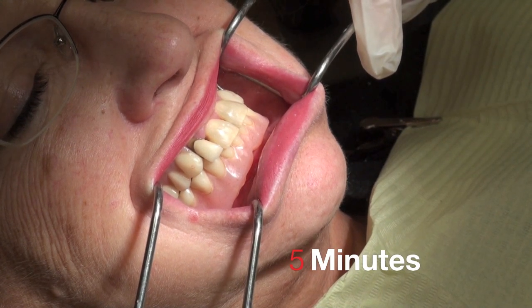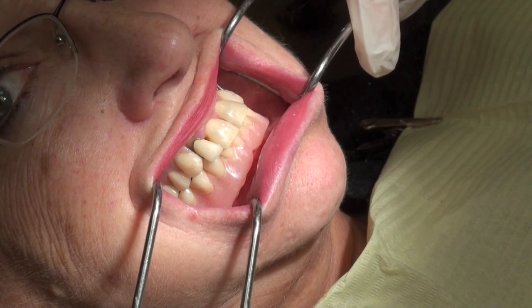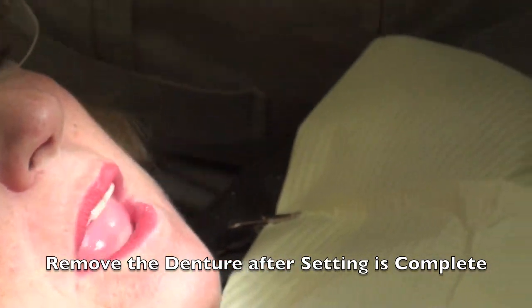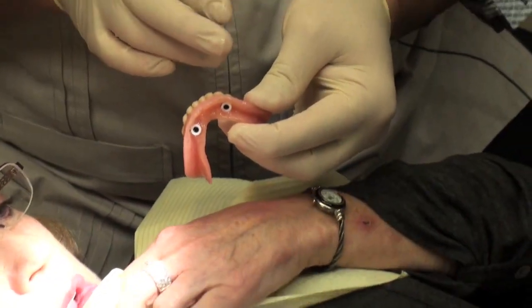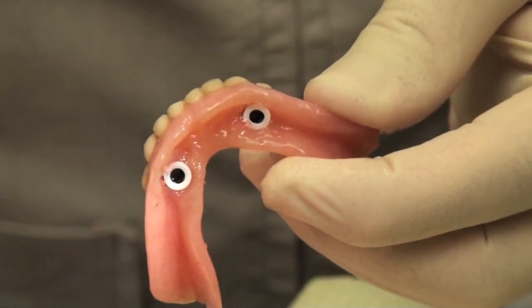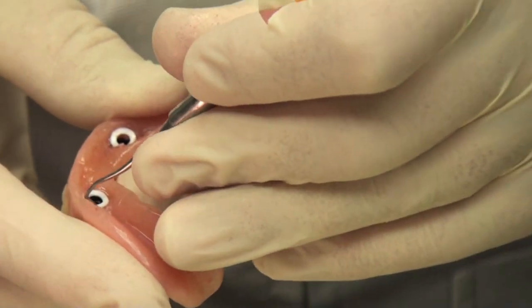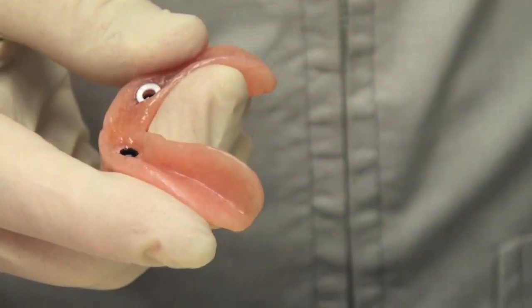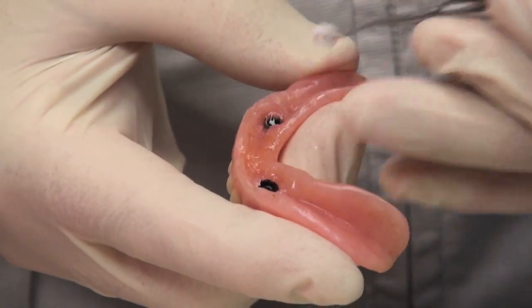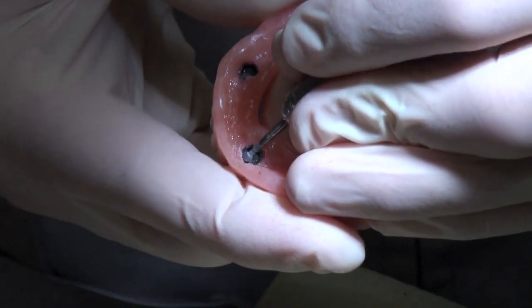It's recommended to let the self-cure time go by about five minutes to make sure the resin is fully cured around those metal capsules of the locators. Then we remove this from the mouth — you just pull it up. The black resilient caps will give a little resistance but not too bad. When you take it off, the little rings that were preventing the resin from entering around the implant will still be attached, so you take a sickle or small instrument and pull them off. Then go in and clean up any resin flash with a round burr.